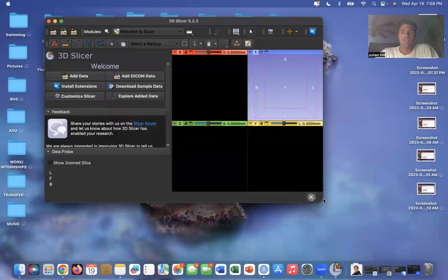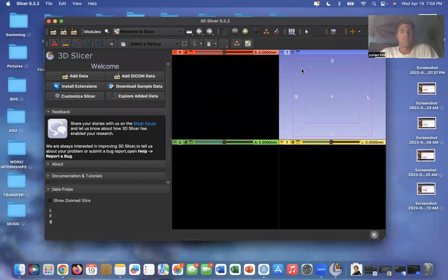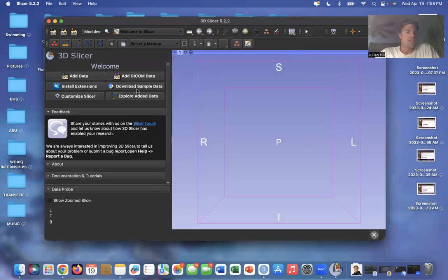Okay. All right, now that it's all open, I like to expand mine personally. I just think it's easier to work. These are some of the four panes. The only one we're going to be working on is this main one right here. So I'm going to use the maximize view button. There's also a center view button, which we'll get into later. So maximize view.